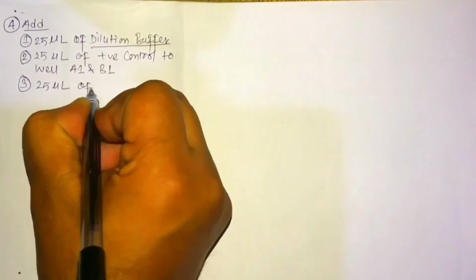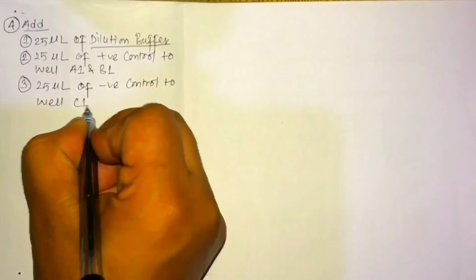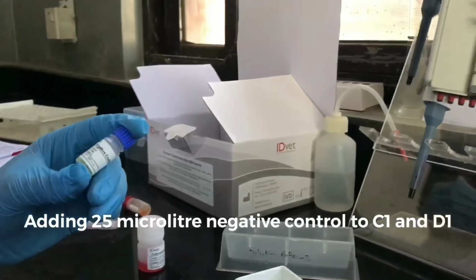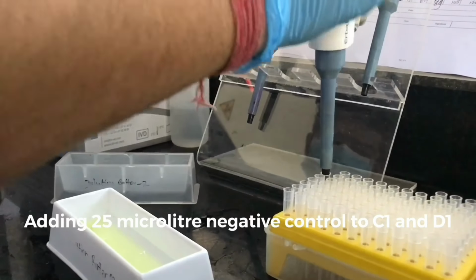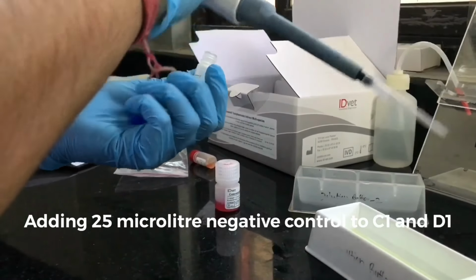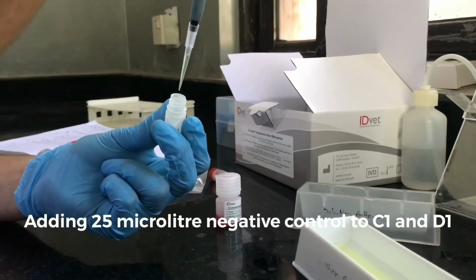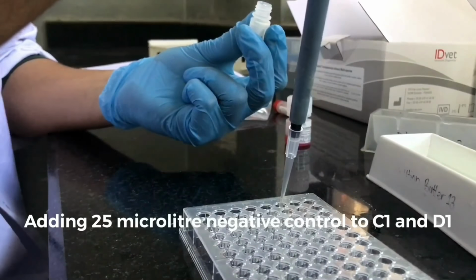Now we will be adding 25 microliter of negative control to the wells C1 and D1. The negative control is also provided by the kit company in the kit box, so we will be using that as well. So taking the micropipette, it is already set to 25 microliter. Now we will pour it on C1 and D1. These are the negative controls.